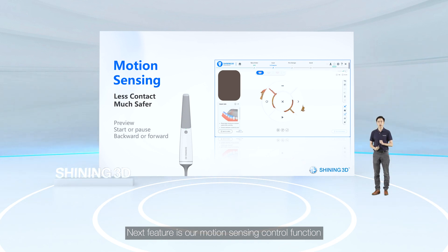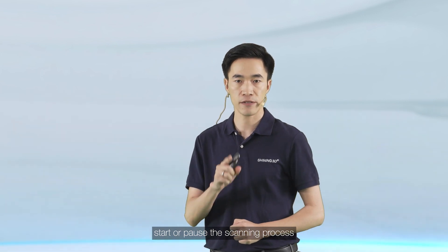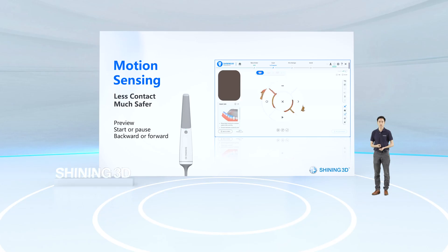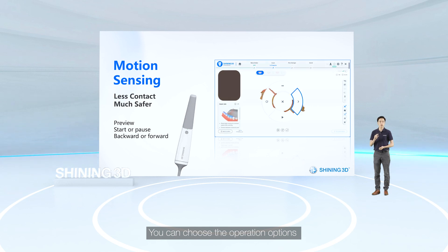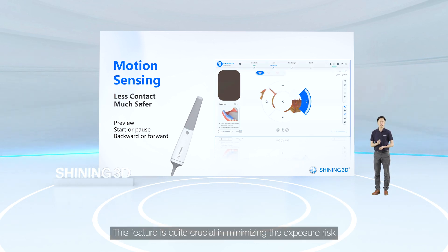The remote control function allows you to carry out the scanning process with no need to touch the screen or the keyboard. You can preview the data, start or pause the scanning process, go backward or forward, and choose operation options by simply swinging the scanner.